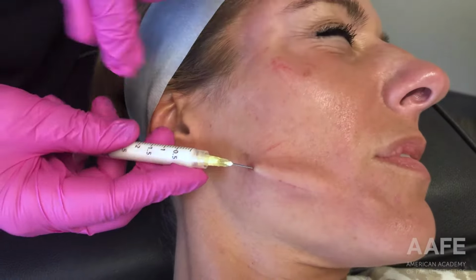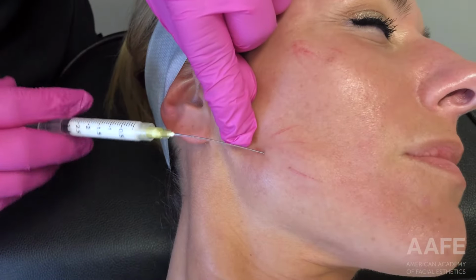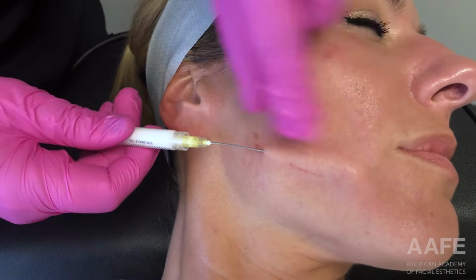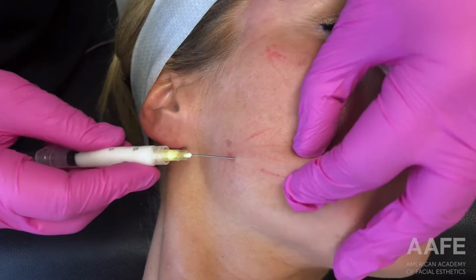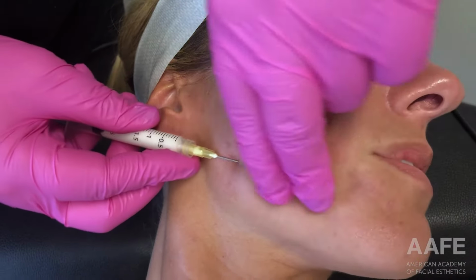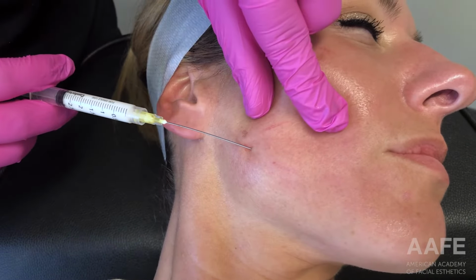So dilute Radiesse is all about distributing the product evenly in your treatment area, in a very even retrograde fashion, placing that Radiesse in a fanning approach. You can see here we're just entering in and out with the cannula and fanning the material in a retrograde fashion to make sure that she has a nice even spread of the dilute Radiesse in her treatment area.